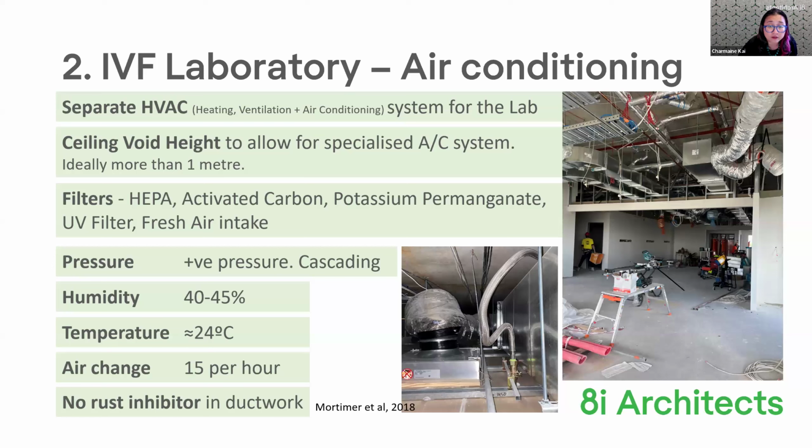So when you have engineers that are helping you design, particularly the air conditioning system for a lab, you just need to give them almost a little bit of education in terms of the particularities of an IVF lab, because it's quite different to, say, a pathology lab or a clean room lab. So they're much more common where engineers will be working on those types of labs. So to be able to educate the engineer in the requirements for an IVF lab is really important. A lot of engineers just assume that an IVF lab is the same as a clean room lab, which it isn't.